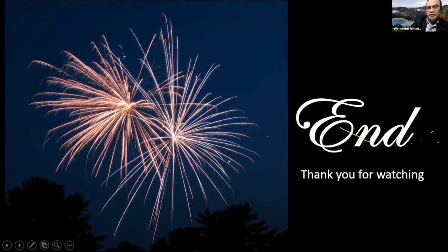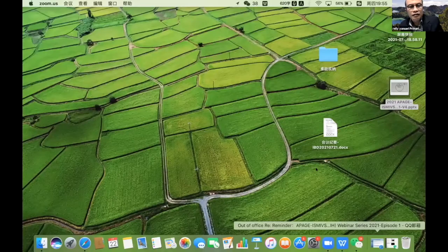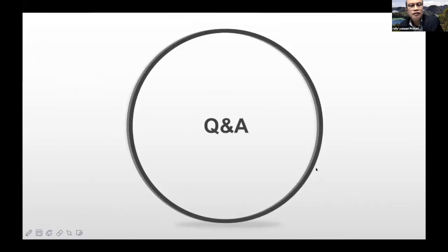Okay, thank you, Professor Felix. Maybe one question from the audience? Okay, one question for you, Prof. Felix. Is there any contraindication for the HIFU?